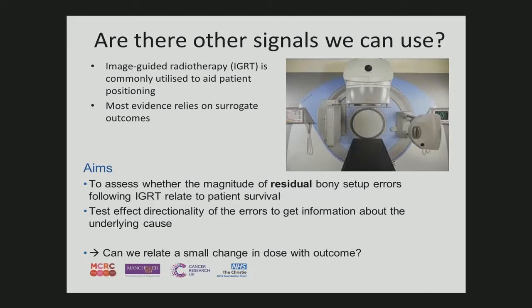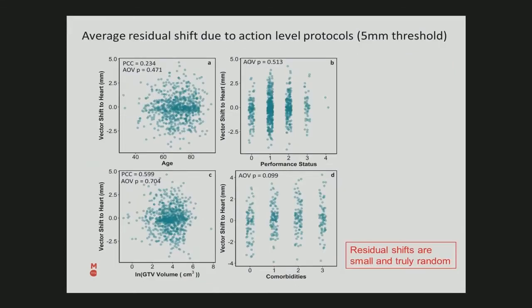Time is all right. So image-guided radiotherapy I told about, that's good. And one of my students that I inherited from another supervisor who retired, she was going to look at the effect of setup errors, small treatment errors, on outcome. And I told her, well, I don't think that you're going to find anything, because the treatments are incredibly accurate. So in some cases the treatment is a little bit off. We accept an action threshold. We accept that the treatment is not perfect all the time, just to save the amount of work. And as treatment equipment gets better, we do that less and less.